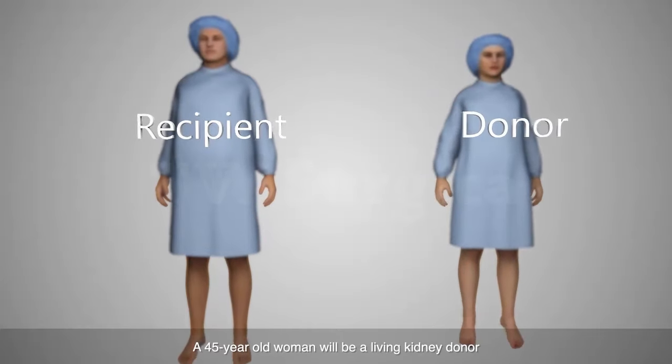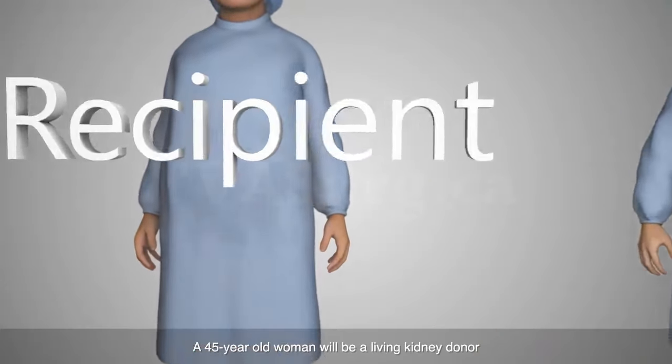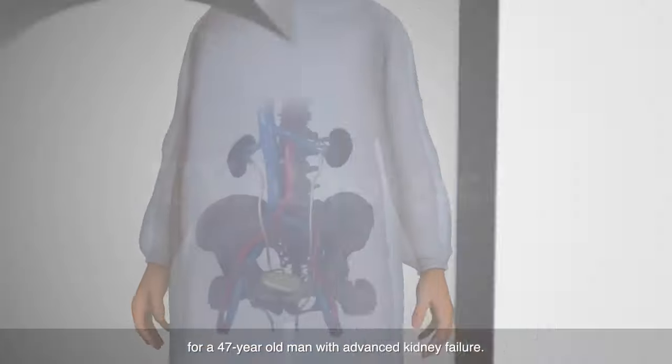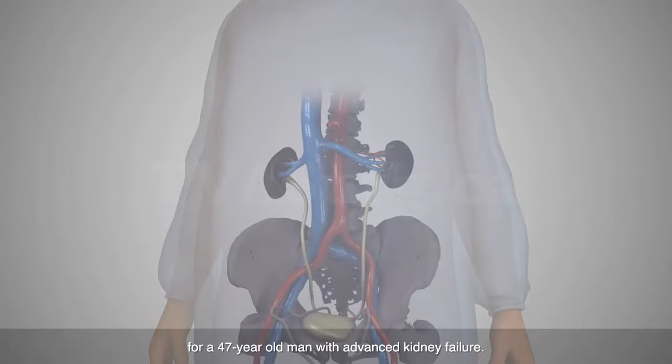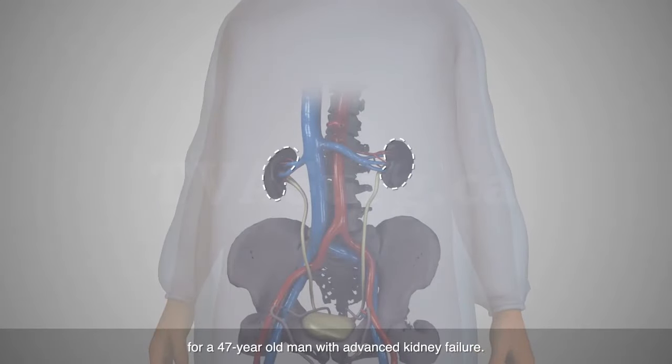A 45-year-old woman will be a living kidney donor for a 47-year-old man with advanced kidney failure.